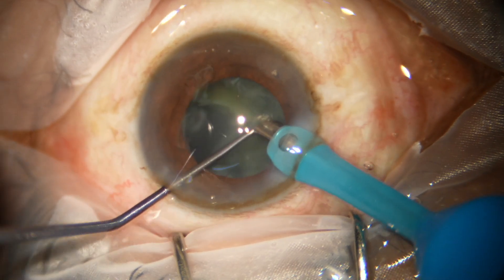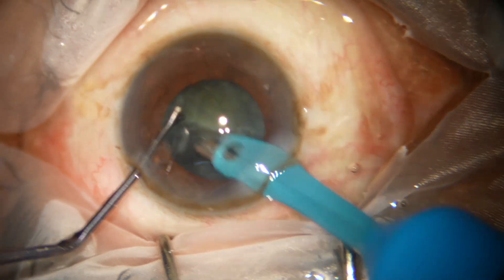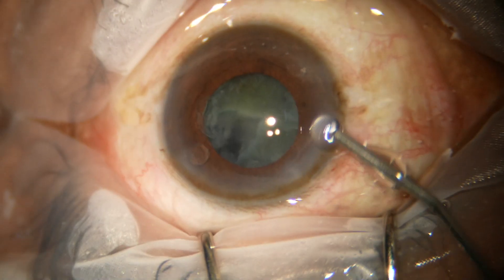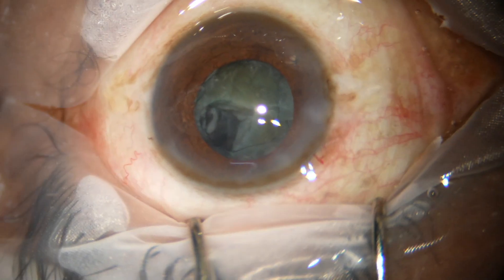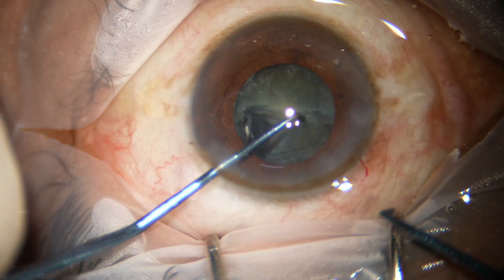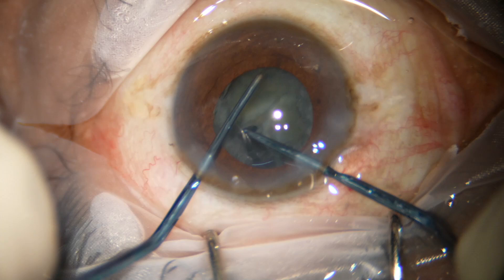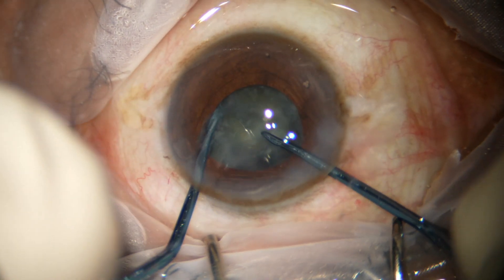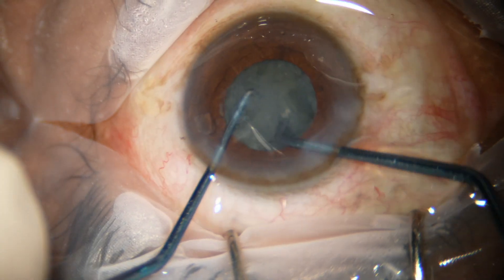Now, after emulsifying one piece, I find it difficult to manage the nucleus and I don't want to hold it, because if I try to hold it, I will make a pit — it will also be difficult with the pre-chopper. So I inject visco, rotate the nucleus, and divide this hemi-nucleus into two pieces.